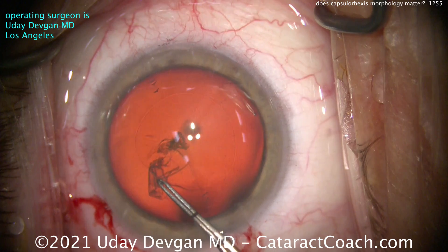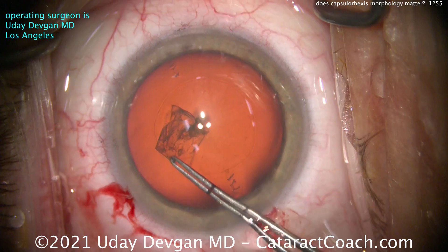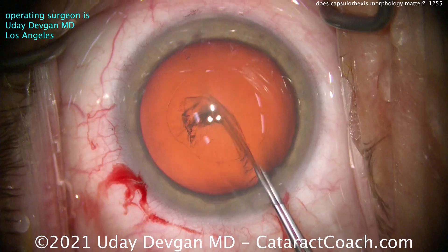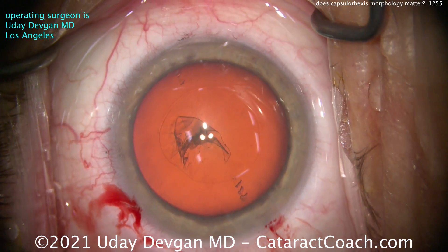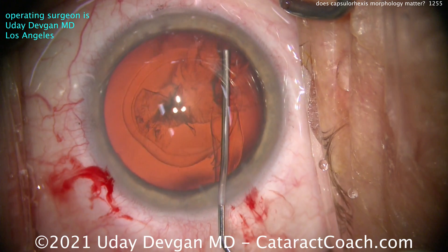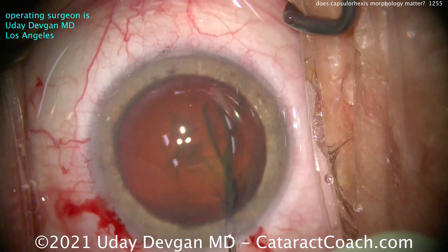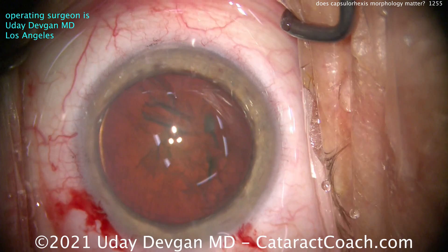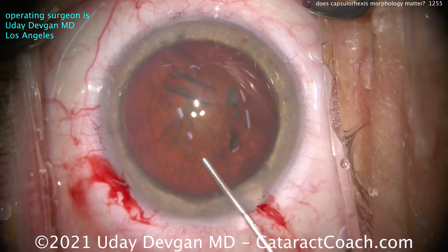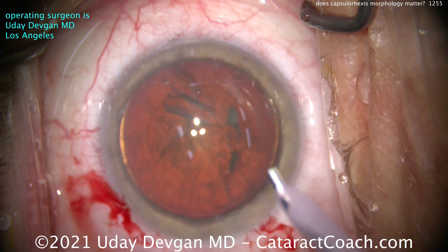We'll measure here at the end using those forceps. And at the last bit, we kind of just lose concentration — a couple of grabs didn't work, finally get it, and finish it up. There's that one area that's not quite perfect. It's not a big deal — it doesn't make a difference. This patient literally had a perfect 20/20 outcome. But it's just that perfectionist mindset. As you do this surgery over tens of thousands of cases over decades, you really take pride in getting it exactly perfect. But I'm happy to say that rhexis morphology actually does not make much of a difference.